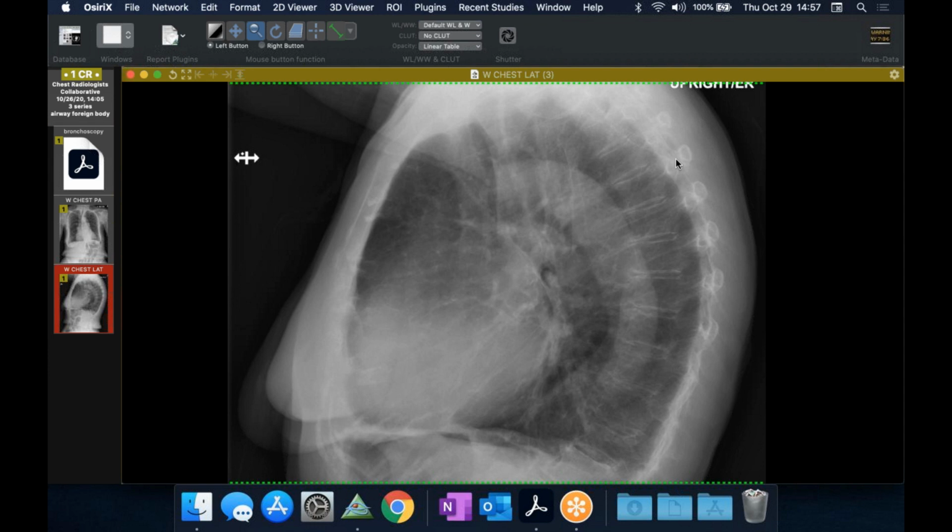Guys, before we go, can I ask a general question? I'm glad Howard's on because he's an expert in ECMO. I've seen a number of cases of people who are put on ECMO for bad heart problems like acute heart failure that's really devastating. They don't have lung disease, and once they're put on ECMO, their lungs just white out to the point that you can't even see heart borders. I wonder if you've seen this, because I've seen it about 5 times. Is there something about ECMO that leads to white out of lungs? Got one person who's recovering from that. It is reversible. Is that a known phenomenon?